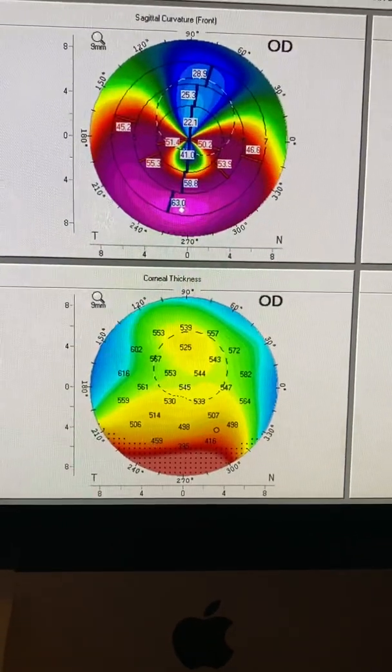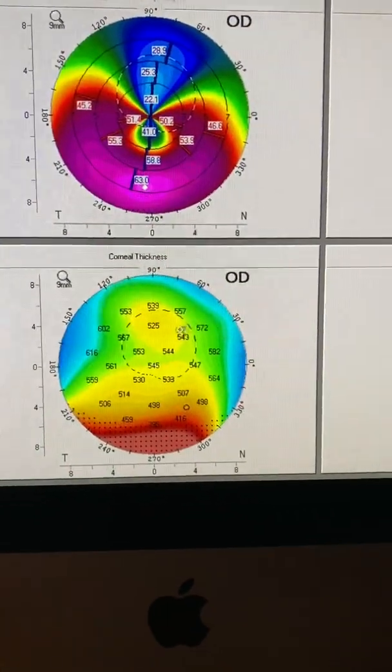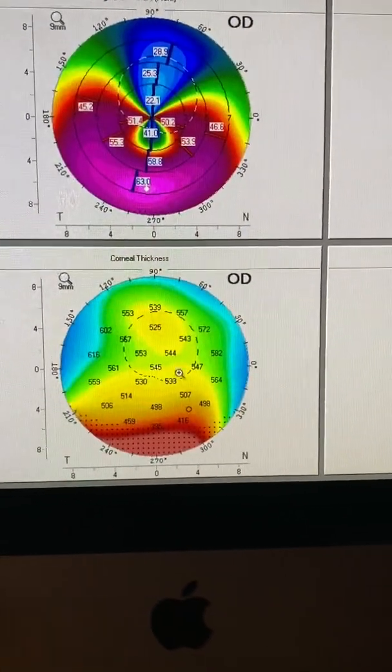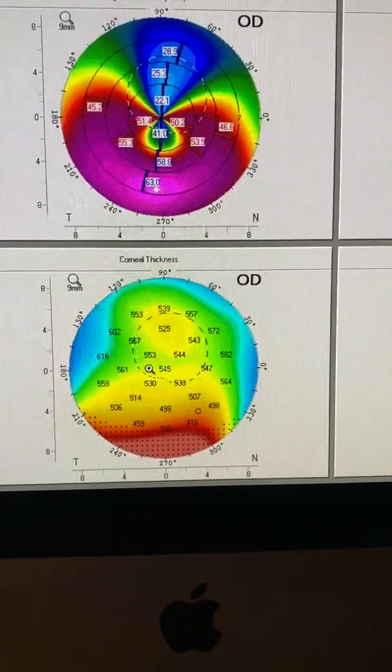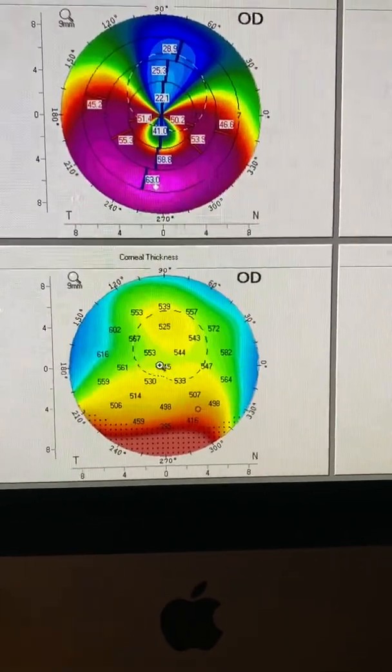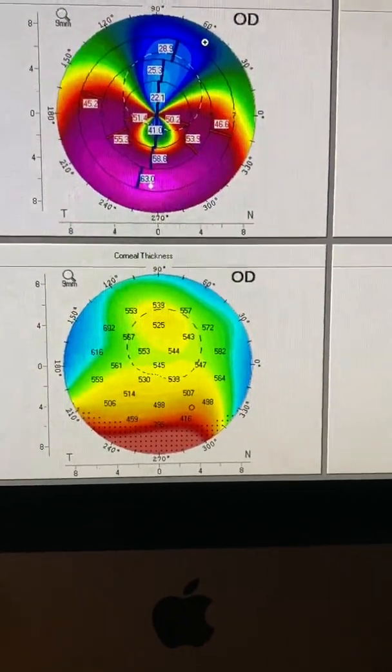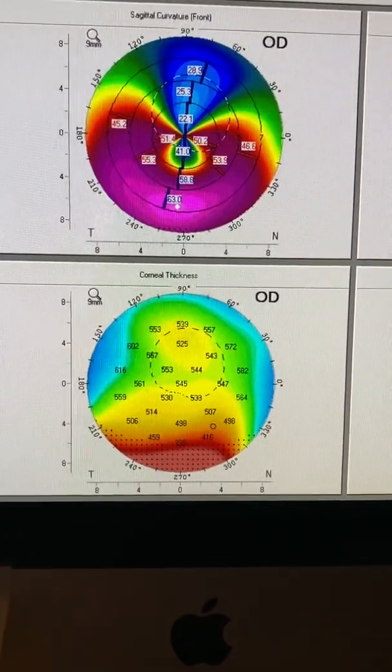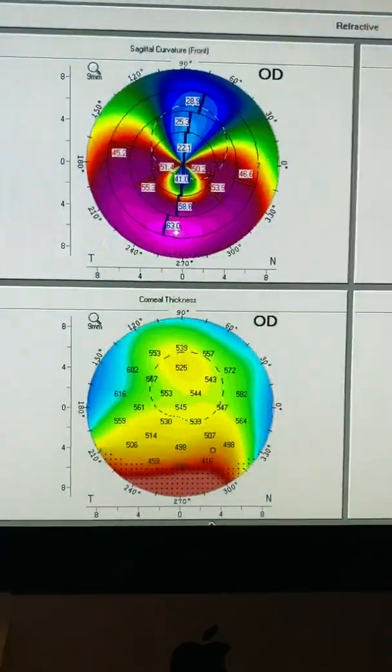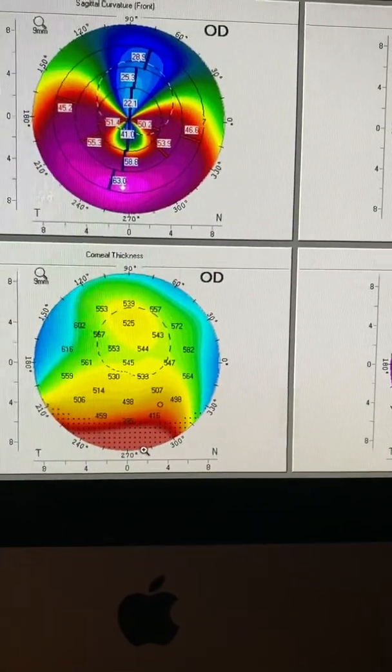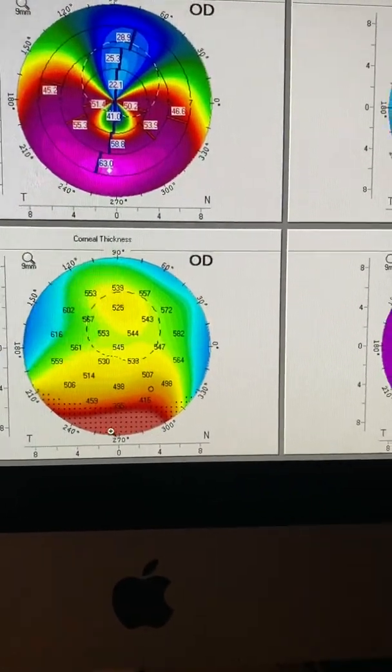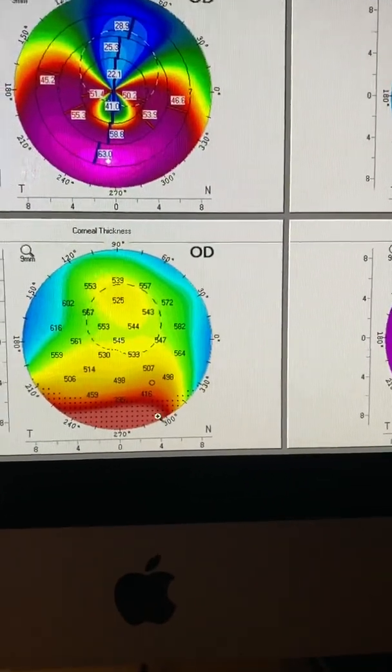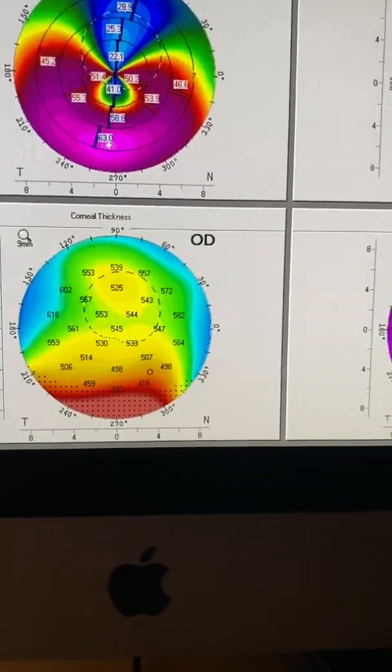To improve visual function with this patient. Remember, in this patient, as with pellucid, central cornea is of good thickness. We're at over 500s in central cornea thickness, where the area in question, the hard area in question, has a minimal cornea thickness of under 390 microns.